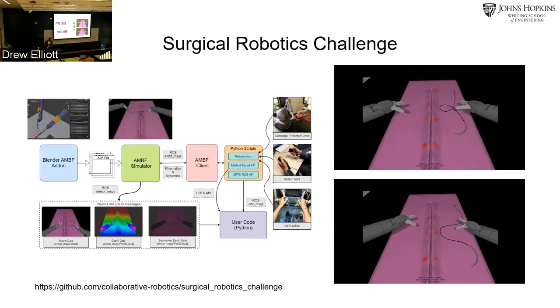It's not deformable, but it fools you well enough to make you think that it's deformable. So the thread is deformable, easy to see. The pink phantom is rigid. What is movable is these head markers. They have a 6D spring. So once you put your needle through, they can deform and give you this effect.